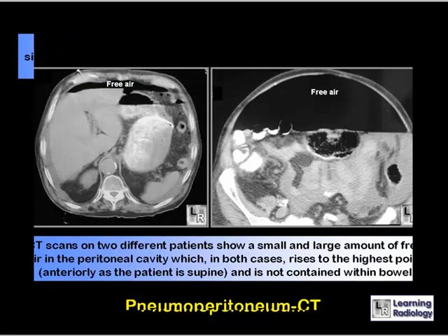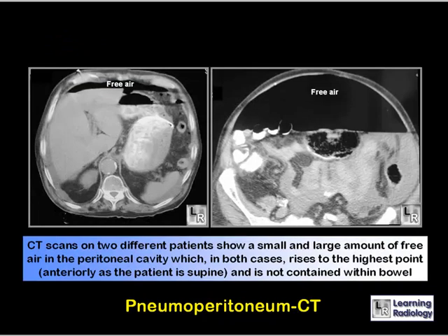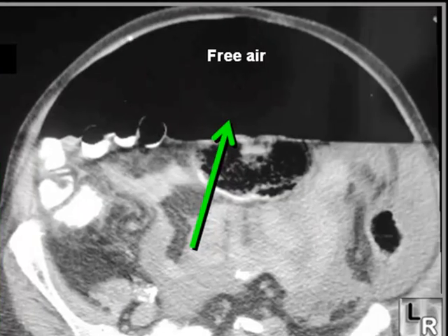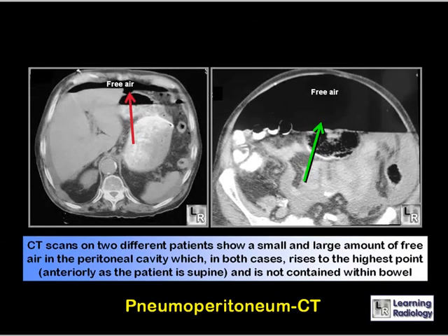These are two CT scans of individuals — one with a small amount of free air, the other with a large amount. Since the scans are done with the patient supine, the air rises to the highest point, just underneath the anterior abdominal wall. Importantly, in both cases the air is not contained within the bowel.